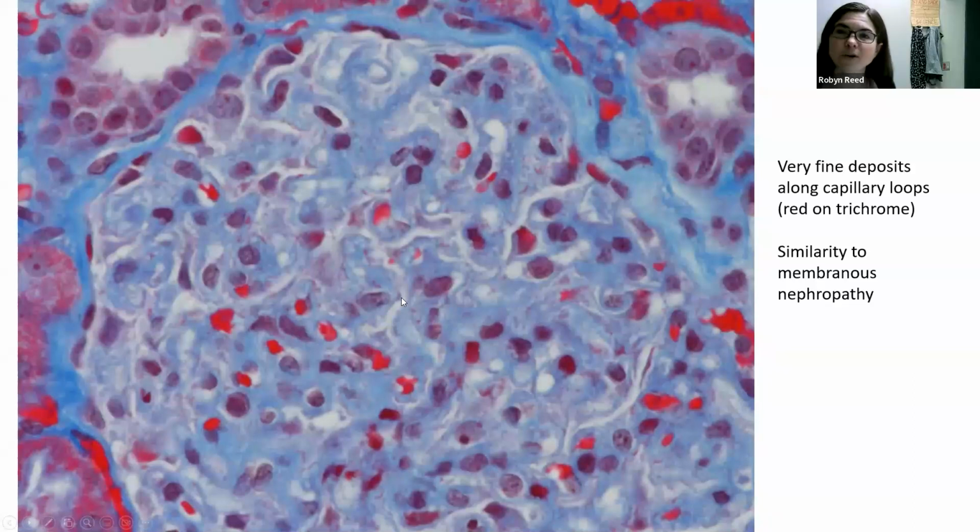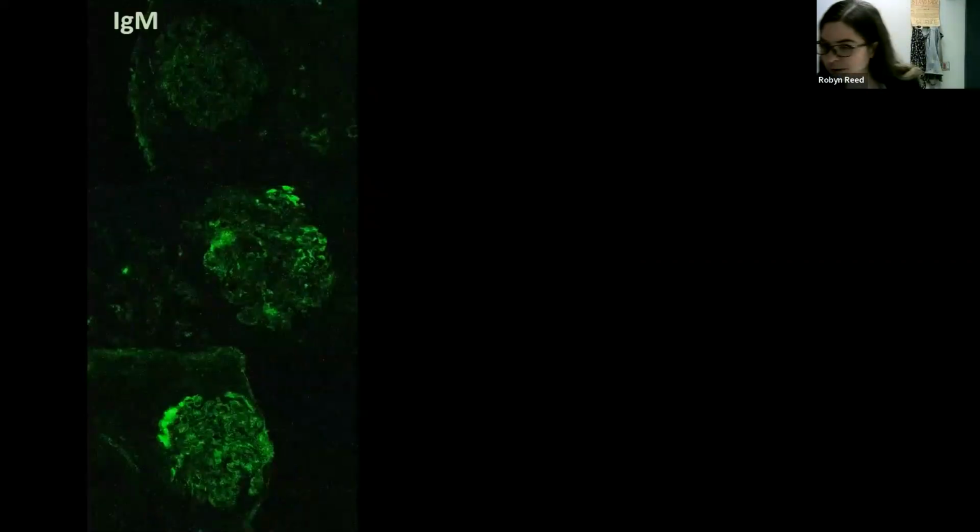So it's important to note that in familial LCAT deficiency, you can have light microscopic findings that are mimics of membranous nephropathy. And in fact, I think one of his siblings, the first one, the sister, when she was initially biopsied, the initial diagnosis was membranous nephropathy. However, the immunofluorescence pattern in this is quite different from a typical membranous nephropathy, although I suppose you could speculate that it could be one of the advanced stage ones where you've had washout of the immune complexes. At any rate, his immunofluorescence was entirely negative for IgG and IgA.